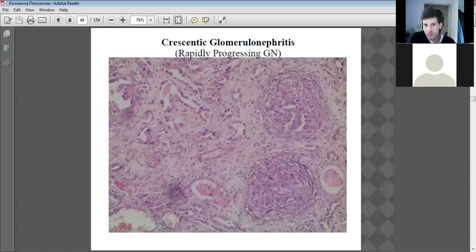Necrosis, by the way, before I go on, necrosis is also beginning to form within the collapsed glomerulus. As we can see, the darkened patches forming there. Not too much, but some necrosis.